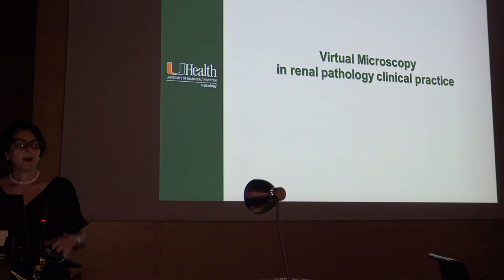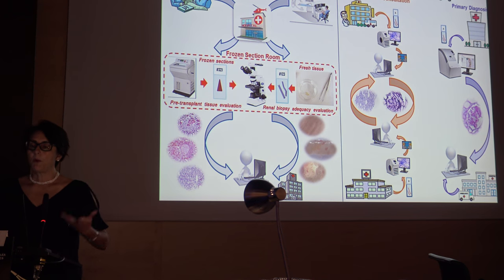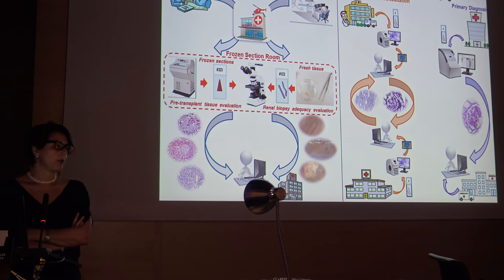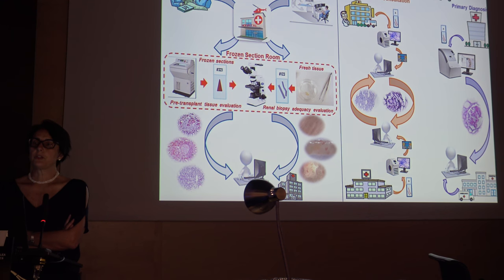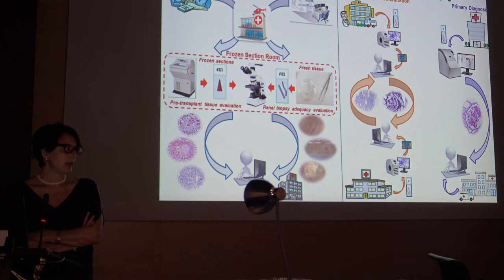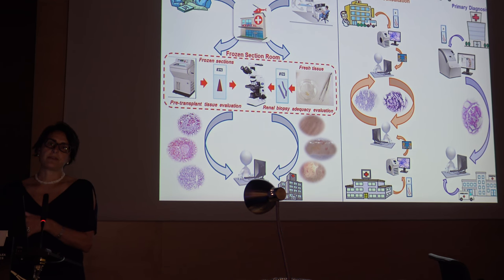So, how do we use digital pathology, virtual pathology in general, in clinical practice? Well, we use both telepathology and whole slide imaging, digital pathology. Digital pathology can be used for second opinion. We store the slides and give permission to somebody else to look at them in our database, or for primary diagnosis under certain circumstances. And Europe is very different from the US.